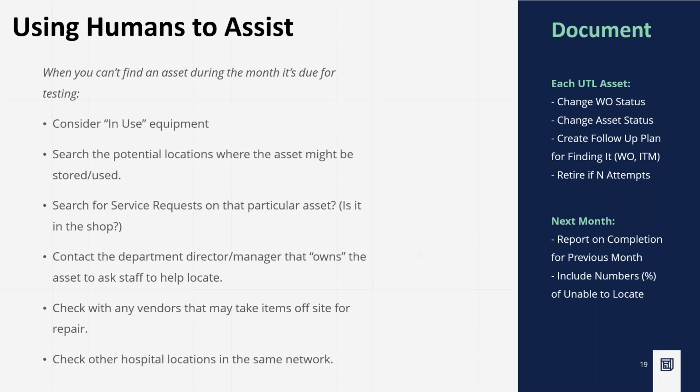If you do have things segmented to different departments, I know people try to do that, like these are the ones for X-ray, here's the equipment for the X-ray area, here's the equipment for dialysis. Obviously those machines will be there, but sometimes equipment moves with the patient to those areas, back and forth. If a patient moves to different floors, or goes to intensive care for a while and comes back, that equipment could be all over the place. But if you know exactly where it was the last time you did the PM, it might help you find it.